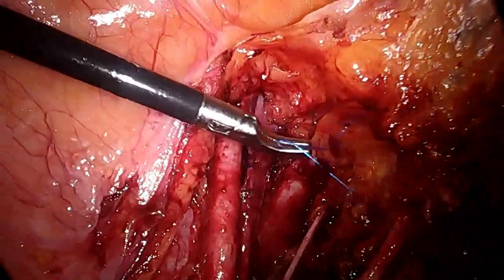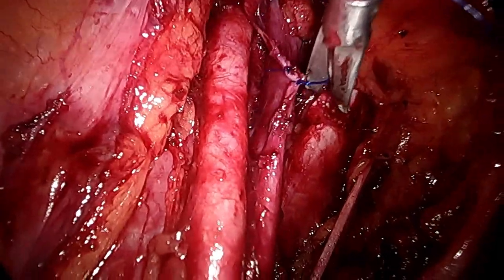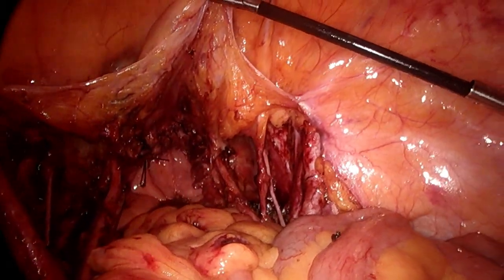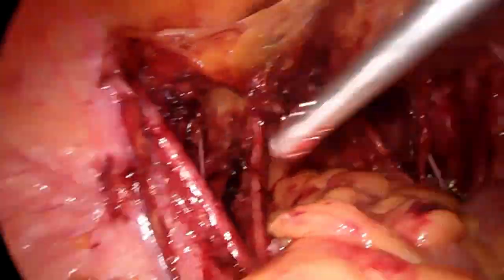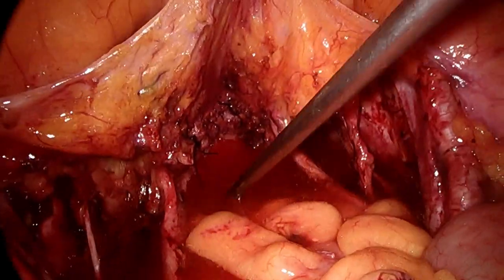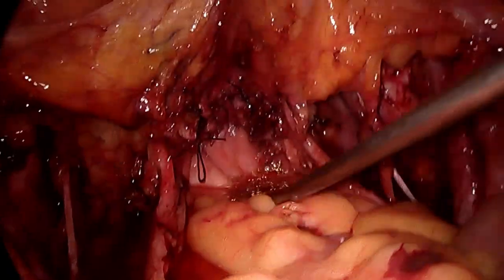The vein is a notorious structure — it has higher chances of injury but it is easier to repair. Specifically, bigger veins are easier to repair compared to arteries. For repairing the artery we need to use a vascular clamp. This is the postoperative picture where we have completed dissection from the obturator fossa and inter-iliac lymph nodes, and we can see the rent of the external iliac vein was not bleeding.